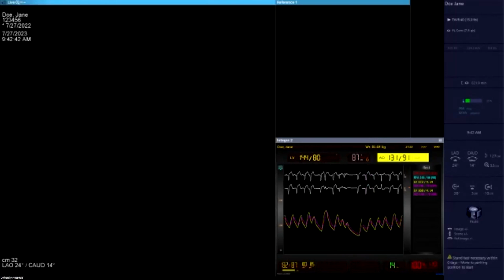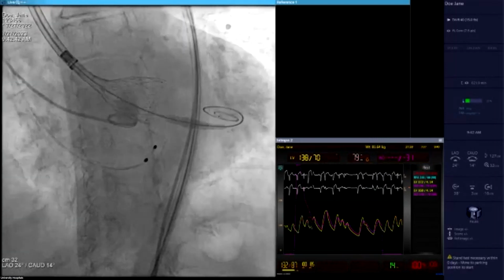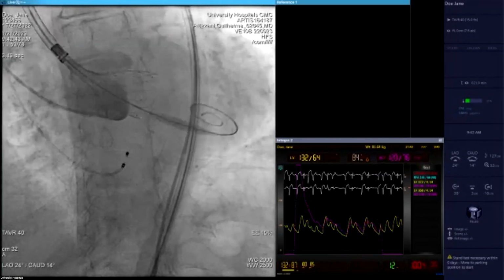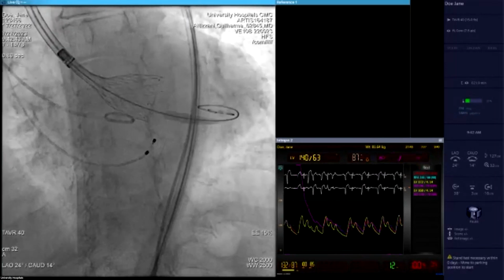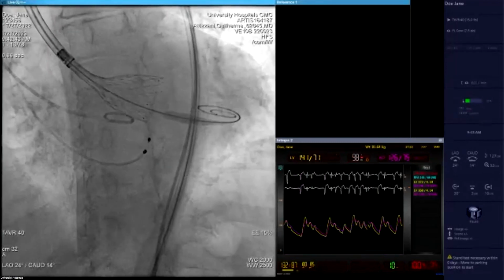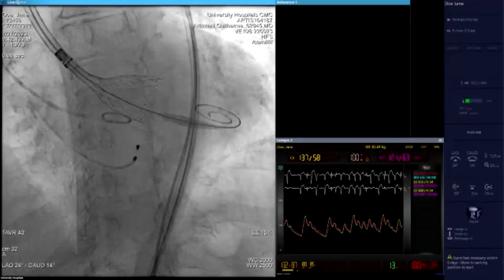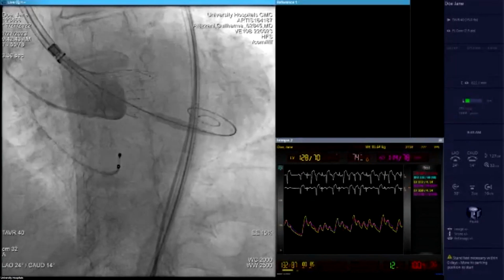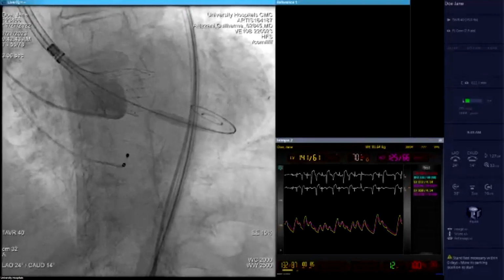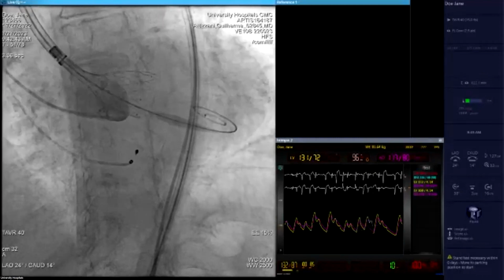Cine. Inject. Happy or frustrated? I mean, you're on the non about 5 millimeters. I think it'll settle down. It'll go up on the left side. I am okay with this. Ideally, you'd get a little bit higher, but it's a judgment call, because you're going to be fighting yourself with this horizontal aorta a little bit. And as you said earlier, as you release with the way the catheter here is in the LAO, it should come up on the left and maybe drop a little bit on the non.